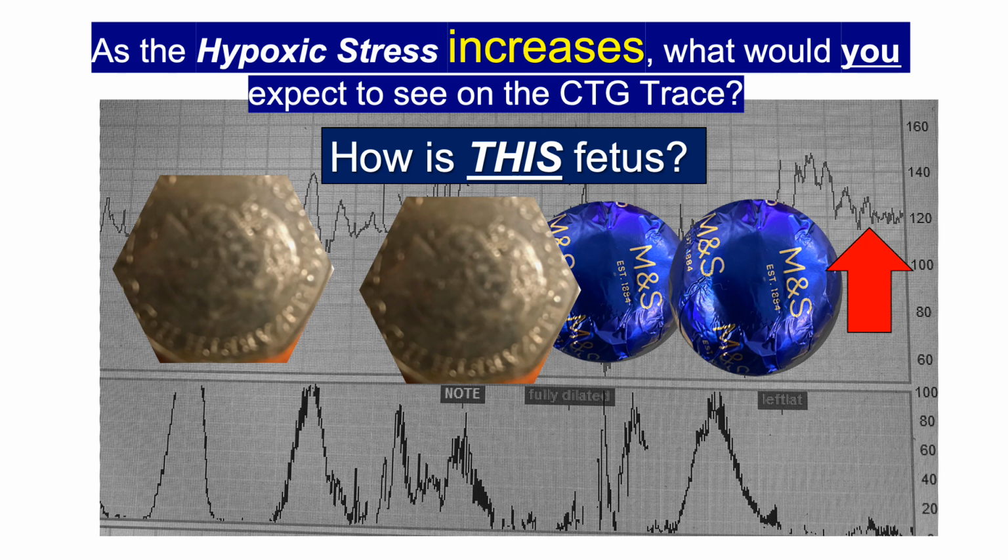This fetus is continuing to show a stable baseline fetal heart rate and a reassuring variability. And therefore this fetus is telling us, despite the ongoing stress of repetitive umbilical cord compression characterized by variable decelerations, I am still okay. I am still maintaining oxygenation to the central organs. But please remember, we need to be very careful because this myometrium is very sensitive to oxytocin. And therefore, if we find changes on the CTG, we need to reduce the stress by reducing oxytocin.